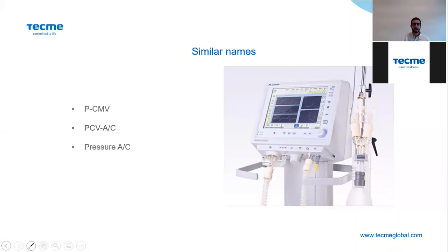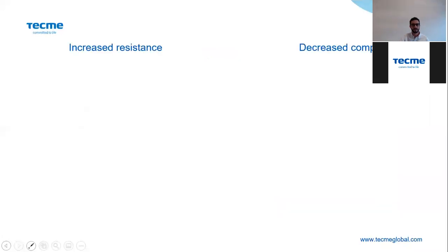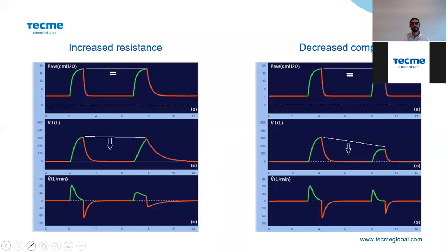Okay, I'm sharing the results with you and let's talk about them here. If the patient's compliance decreases, we have the same pressure because we are in a pressure control mode, but the tidal volume will decrease, because the compliance is lower.